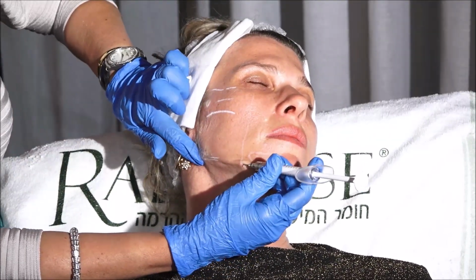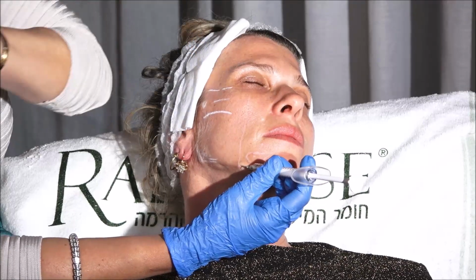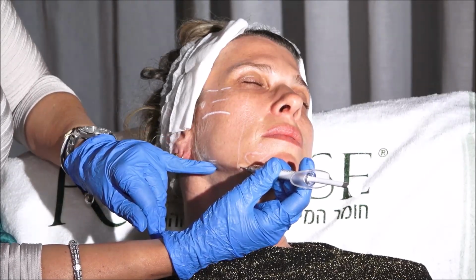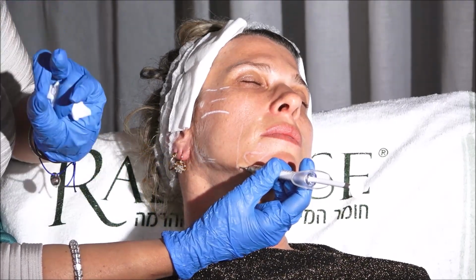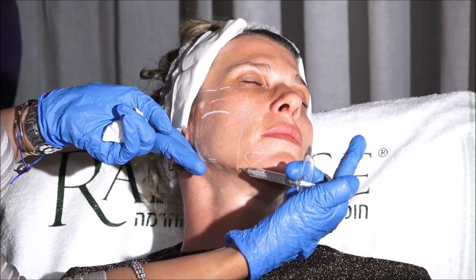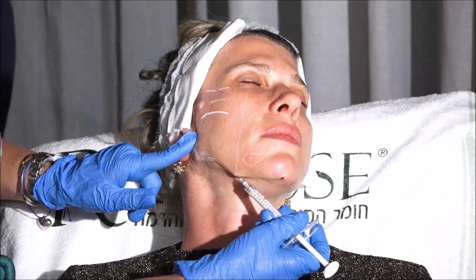And I want to get back on the angle. I don't want to get lateral. I don't want to widen the face. So I do 3 points for a woman, equal 0.2 ml. 1, 2, 3. If it's a man, I will put another point here because I want more square. So let's do it. One centimeter here and 1 centimeter up here.